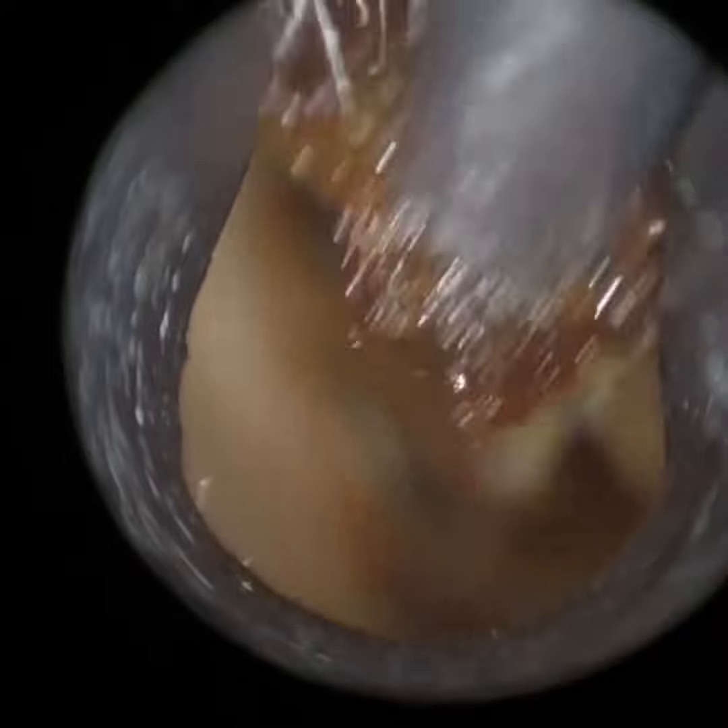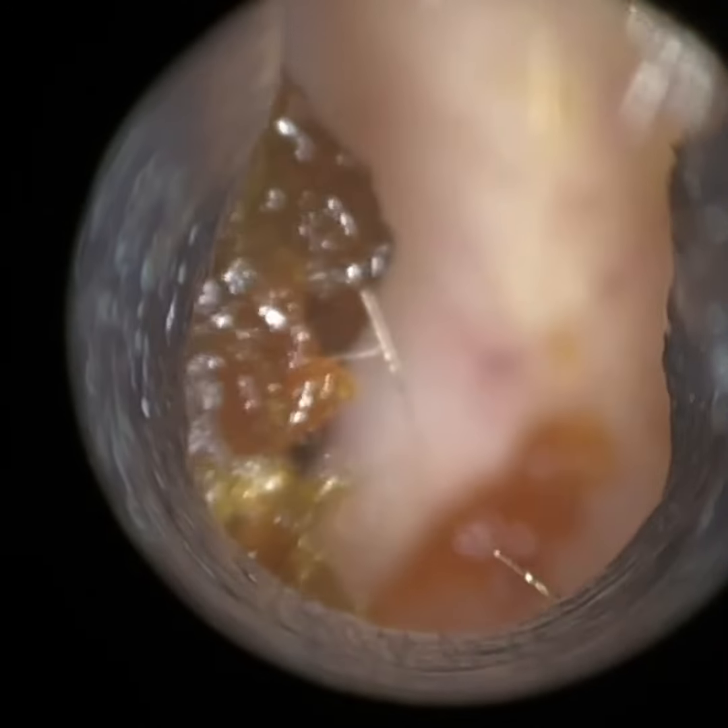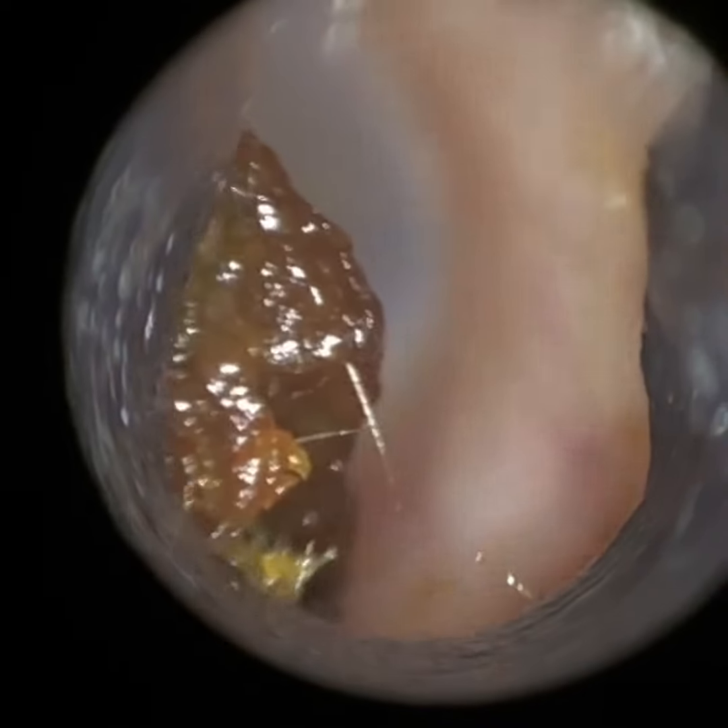We have a patient here who attended with bilateral dark earwax, and we're just in the left ear here. I'm using our 4.25mm speculum to straighten and dilate the ear canal. The specula come in different sizes — a smaller 3.5mm diameter speculum for more narrow pediatric ears, and then two larger ones, a 5mm and a 5.75mm, more for your mastoid cavities.